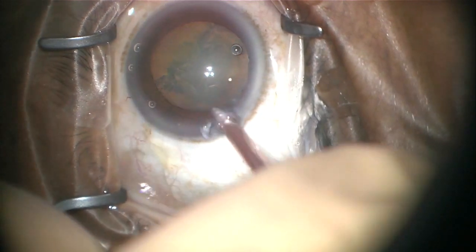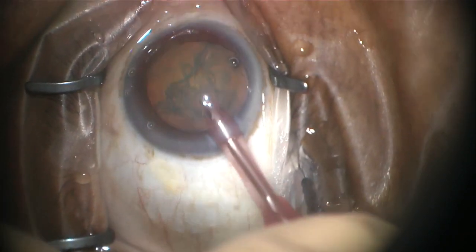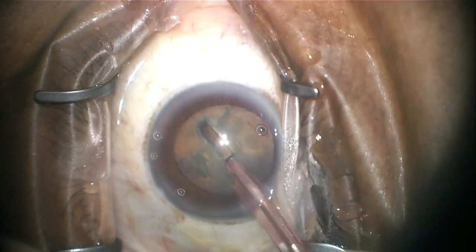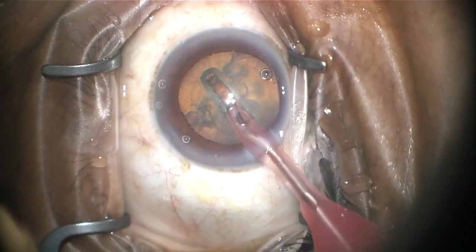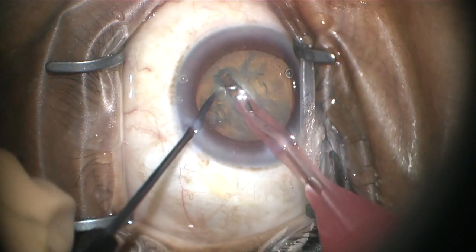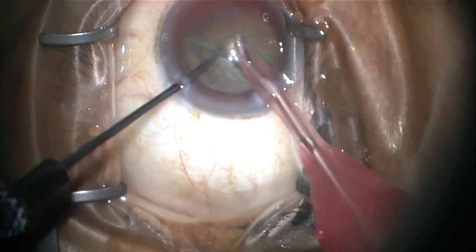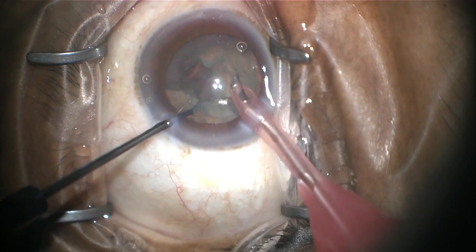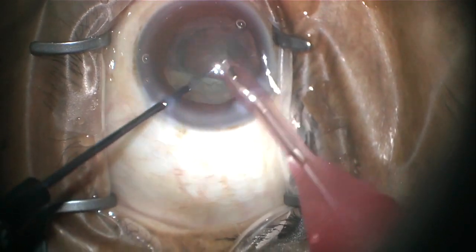The ultrasound is then inserted into that primary wound and a little bitty groove is then phacoemulsified into the center of your cataract. A second instrument is then passed through that little bitty wound on the other side, and the cataract is then broken into two pieces.